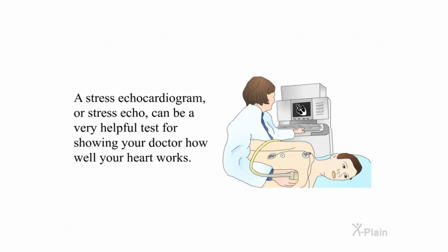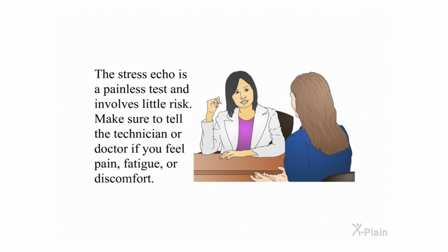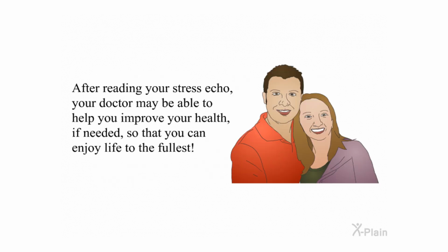Summary. A stress echocardiogram, or stress echo, can be a very helpful test for showing your doctor how well your heart works. The stress echo is a painless test and involves little risk. Make sure to tell the technician or doctor if you feel pain, fatigue, or discomfort. After reading your stress echo, your doctor may be able to help you improve your health if needed so that you can enjoy life to the fullest.